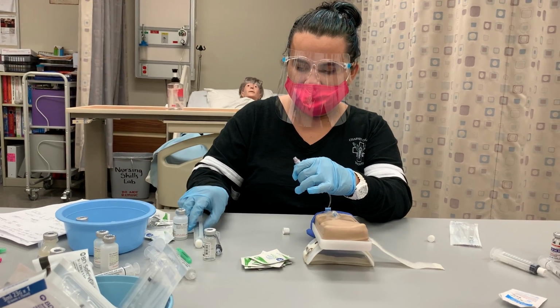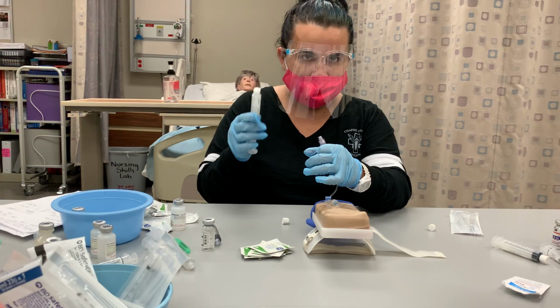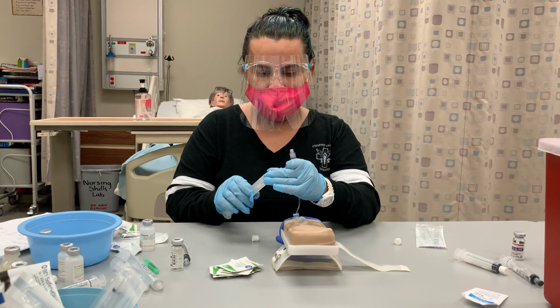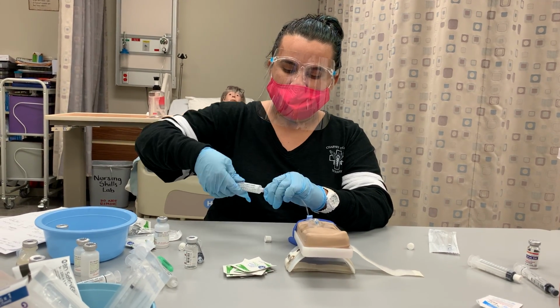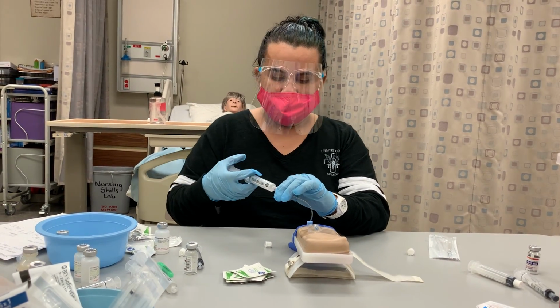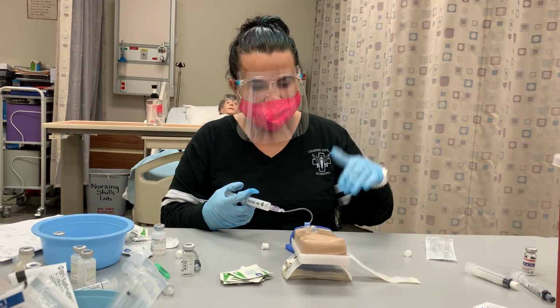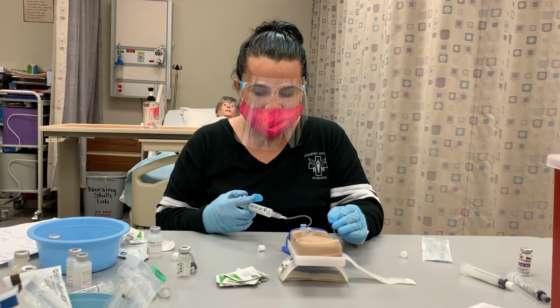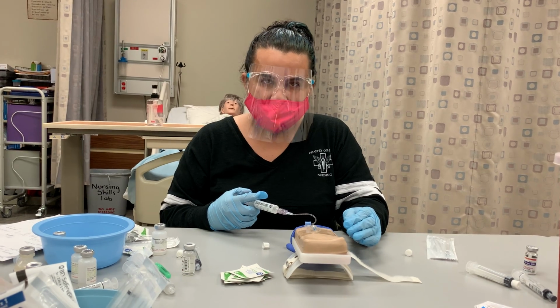Okay, and then we would grab again our normal saline flush that has 6 mL, because we want it to be equivalent to our medication dosage. Again, this process would also require us to push this over 4 minutes, every 30 seconds, 0.75 mLs. So we would do it slow enough where we are following this standard.